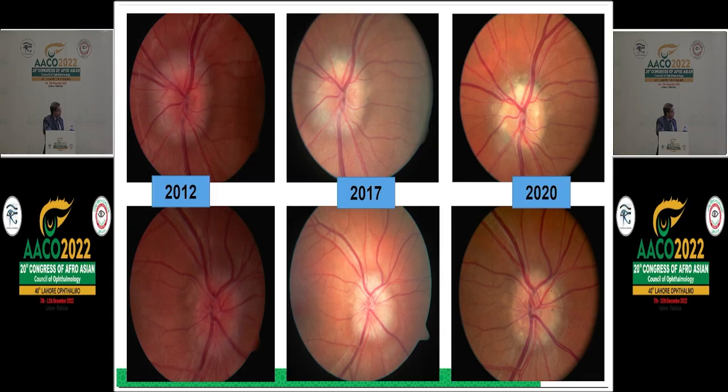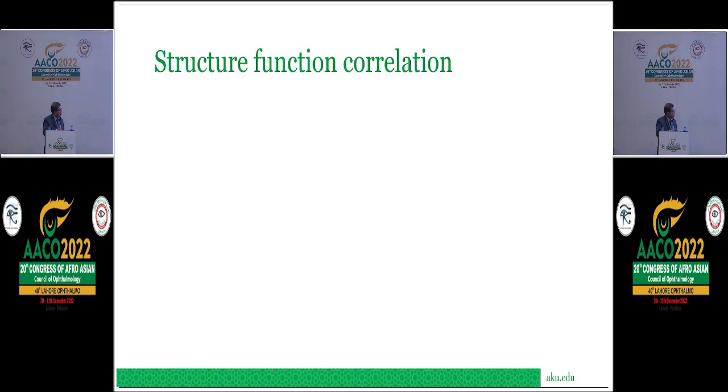So most likely, this is not a case of something serious from the brain, papilledema, etc., or intracranial hypertension, but rather disc drusen. And the OCT is helpful to follow the patient, and the cross-section of the OCT can be helpful as well. I'll just pause there for a minute. Any questions before we go on? It's a bit of a challenging case.